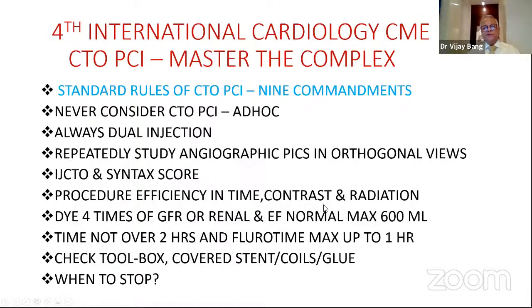And there are 9 commandments. Before we start a CTO program, we must understand that there are 9 commandments to follow. Never consider CTO PCI ad hoc, unless you are very clear that there is a trickle of antegrade flow and a microchannel, and the duration of the CTO is short, 3 to 6 months. You can try escalation with a low tip load polymer jacketed wire. And always do dual injection, meaning right and left coronary injections should both be done.